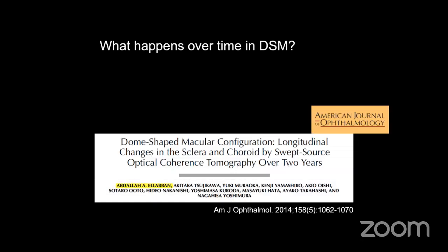And then we asked ourselves, what happens if we monitor these cases for 1 or 2 or 3 years? So we did another study checking the 2-year changes in the sclera and choroid in patients with dome-shaped macula.